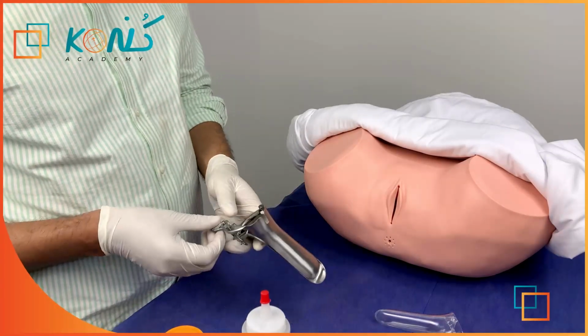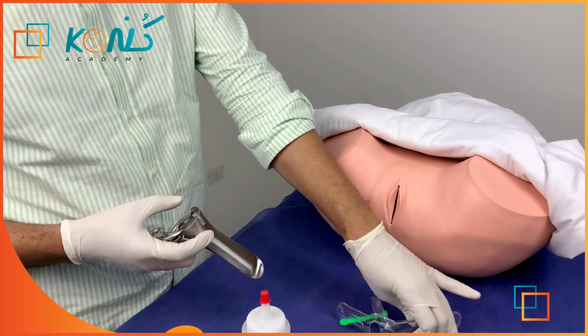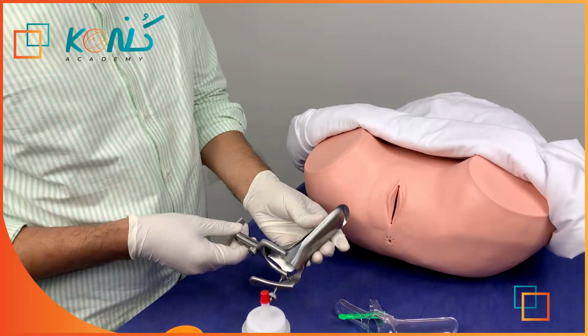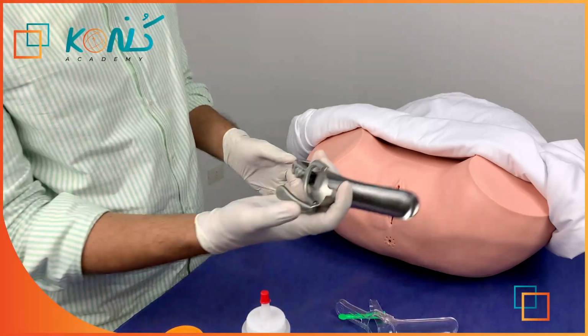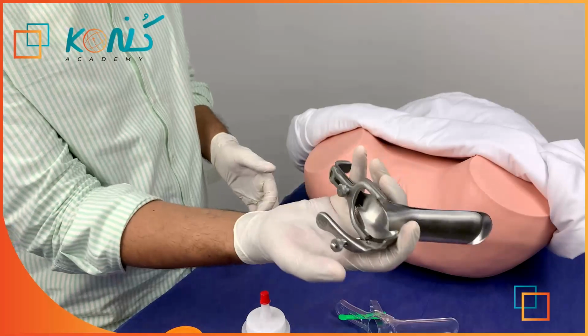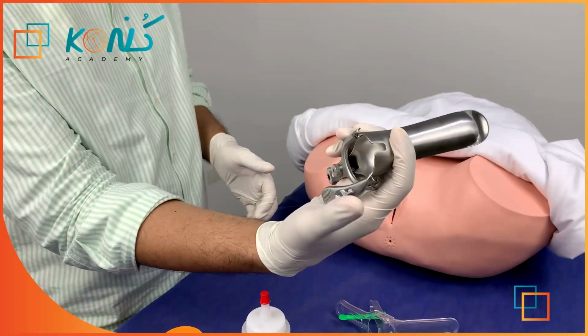You should firstly pick the speculum, either the disposable plastic one or the metal one. Recently, the metal one is the one which frequently appears in the exam. And I told you about the ideal way to hold it like this. This speculum is closed right now, and ideally you should pick it like this.